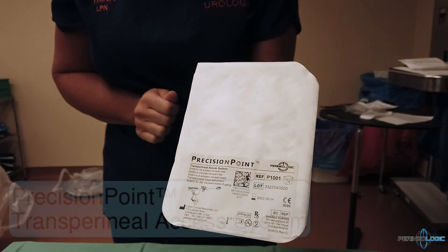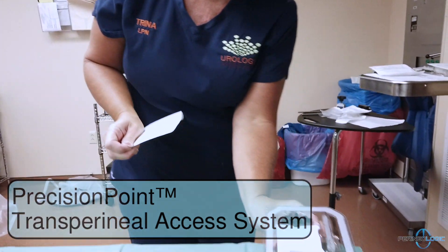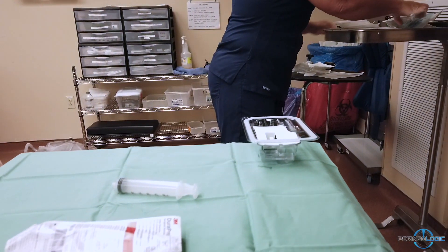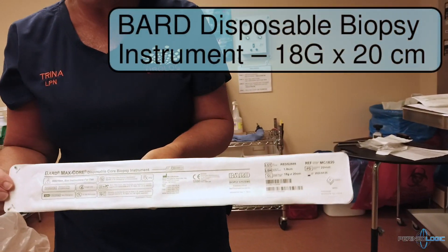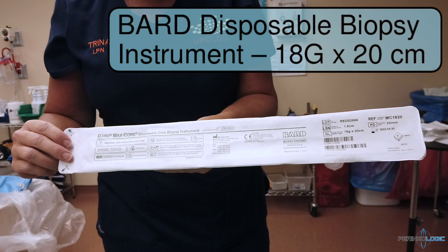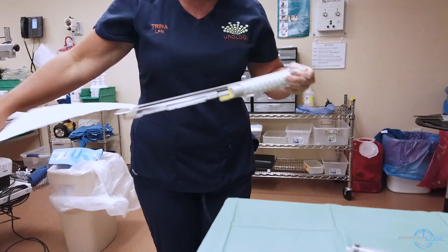Then, we will open the packaging of the Precision Point Access System. We will bring out the biopsy gun, which in this case is a barred disposable biopsy instrument, 18 gauge and 20 cm in length.